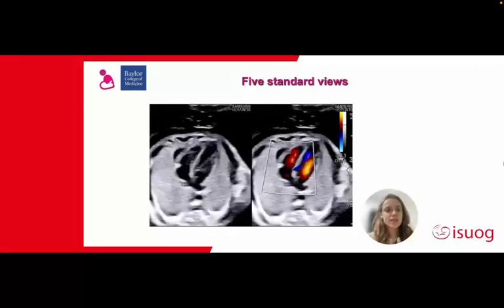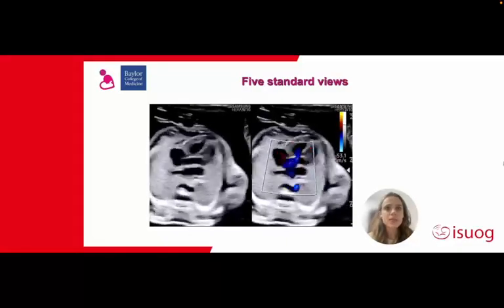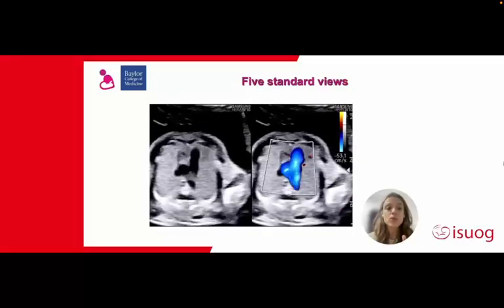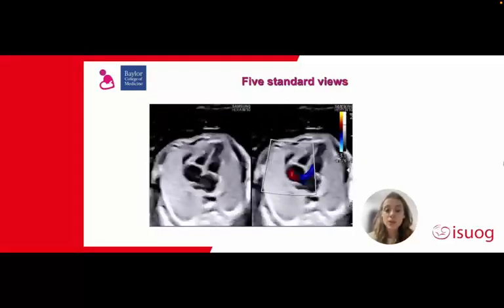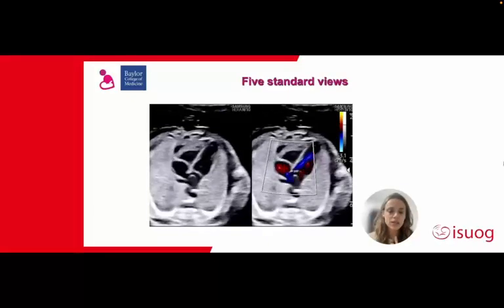And of course, whether it's ready nowadays or it will come in the future, or our software in particular does not have it, everything that we do in B mode, we also need to do, and we also need to acquire and be specific in color when assessing in color Doppler.